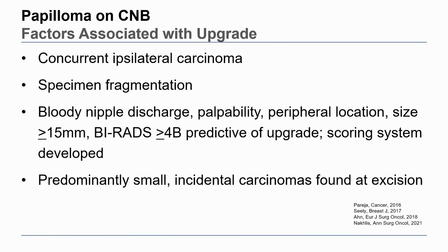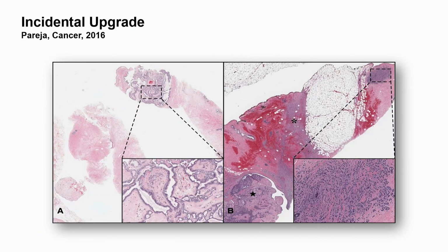But the carcinomas, again, when seen, are often small incidental carcinomas, and that can be nicely illustrated by this paper from the Memorial Group, where we see the benign intraductal papilloma on core needle biopsy here, and here in the excision, again, benign intraductal papilloma here, and then sort of remote from the lesion really is a small invasive lobular carcinoma.